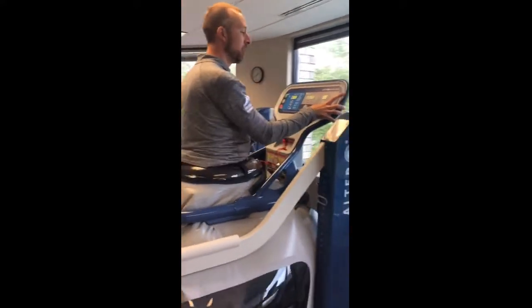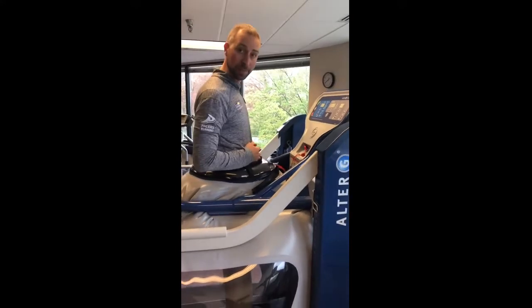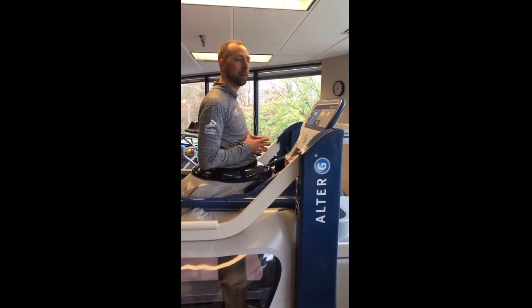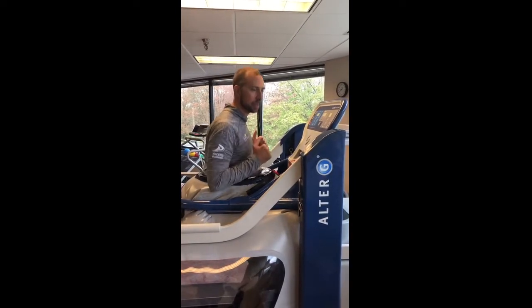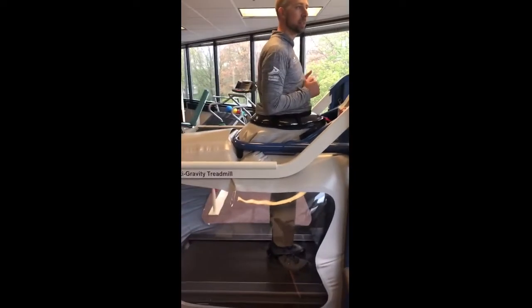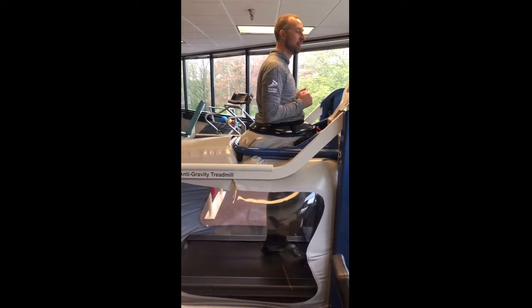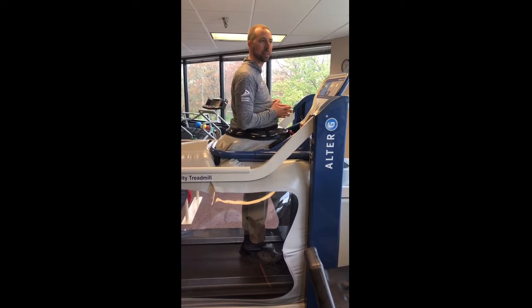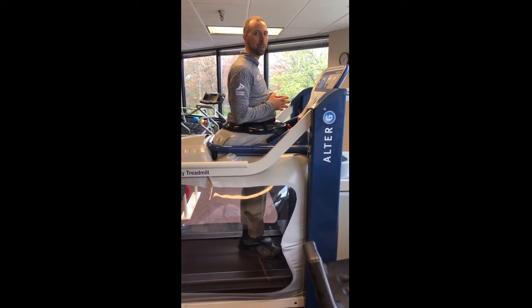The other nice thing about the Alter-G is that you don't have to walk in it — you can also do exercises that take away your body weight. At 65% of my body weight, I can do exercises like squats, toe raises, kicking your leg out, or marches. It's just a really great way to recover faster with less impact, especially for those athletes that can't put full body weight on their legs.